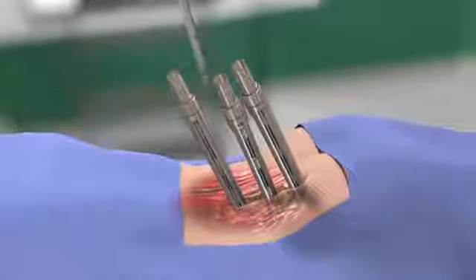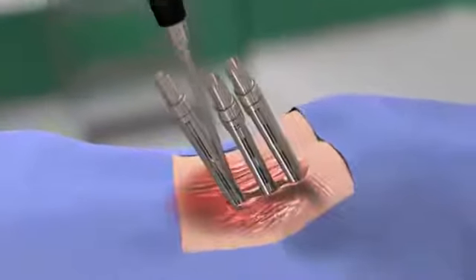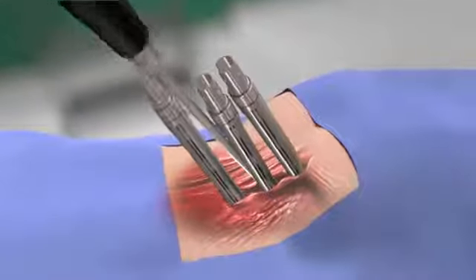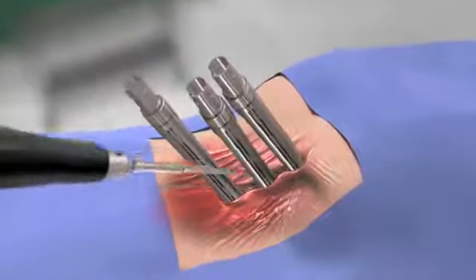When all pedicle screws are in place, dissect a tissue plane between the screw heads to create a pathway for rod placement.